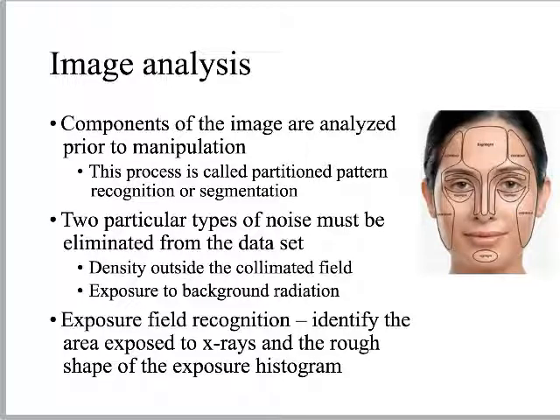So in a similar regard, where this makeup program has said divide the human face into these segments, the same thing the computer is doing with our x-ray images. It's dividing them into segments. And it's saying I need to apply this filter to this area and this other brush to this other area, right?